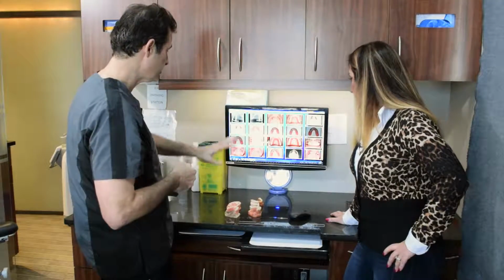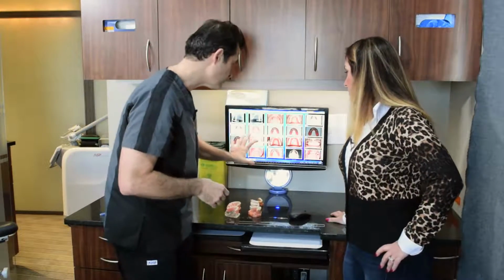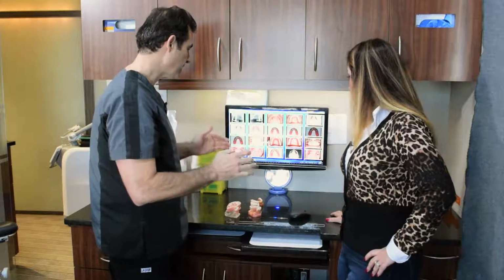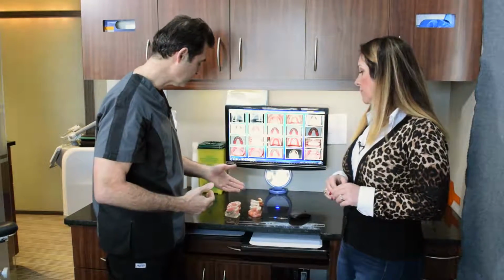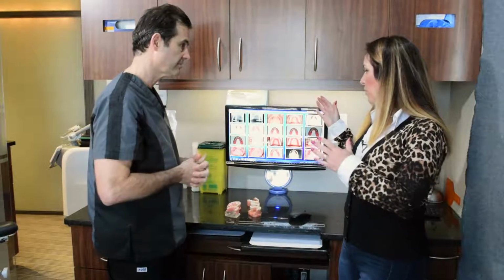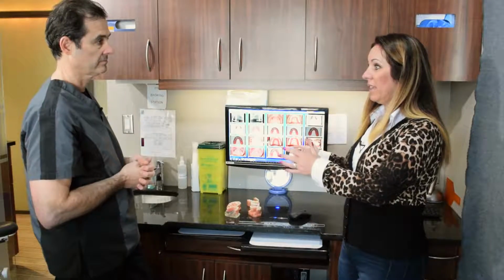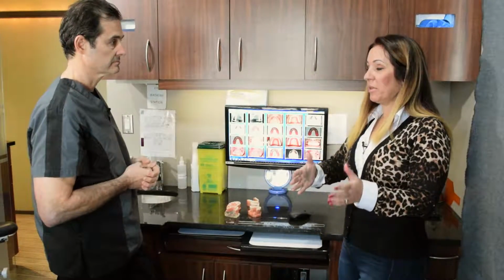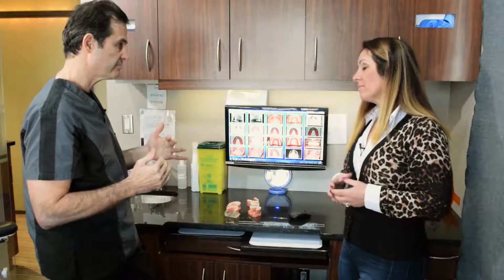So a bar over denture, this is the Cadillac of dentures. Okay. I really love bar over dentures. They're moderately affordable compared to other options. They're more expensive than the clip-on denture that I showed you a moment ago. But would you rather someone spend that money now and do this now than have the other problems we've talked about later? Yeah, bar over dentures can be done at most stages of bone resorption.